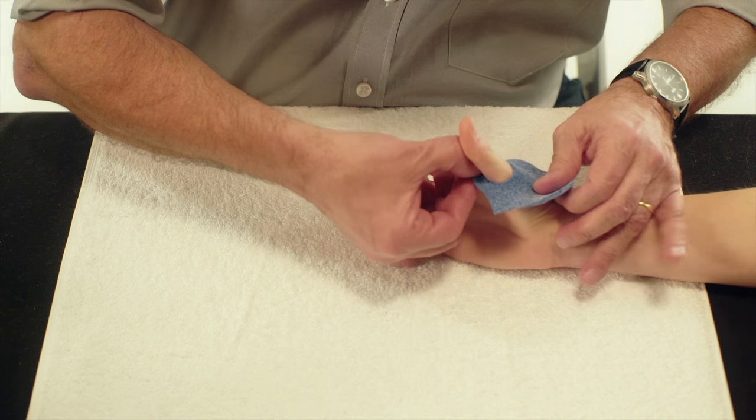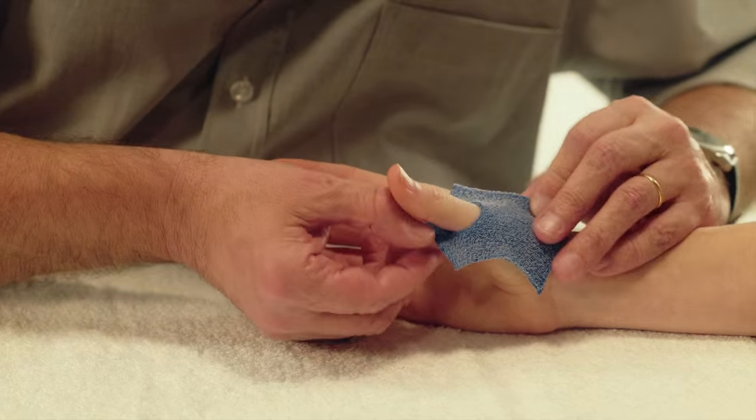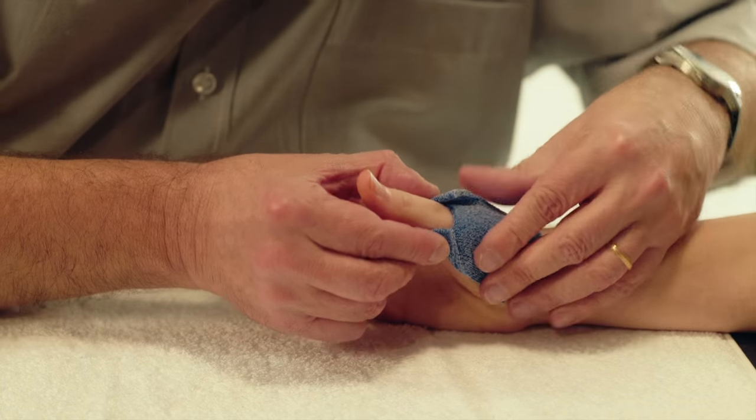Pass the material over the thumb. The larger piece of the material will cover the dorsal side of the base of the thumb.